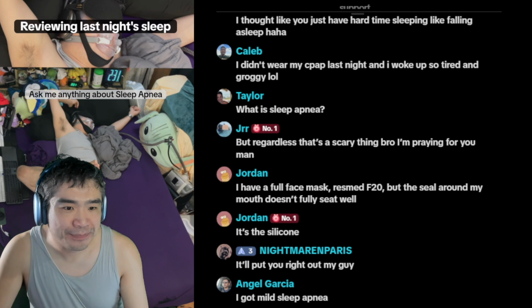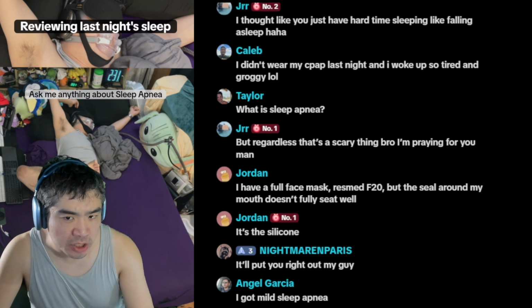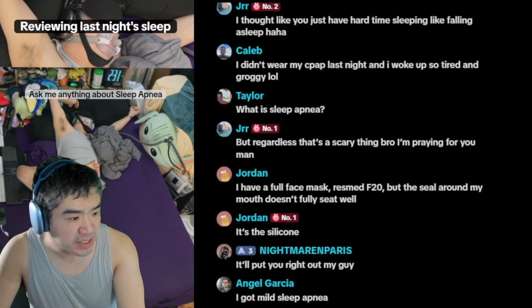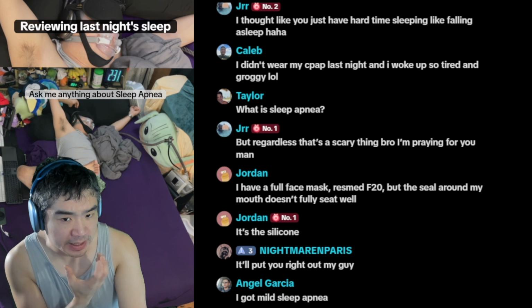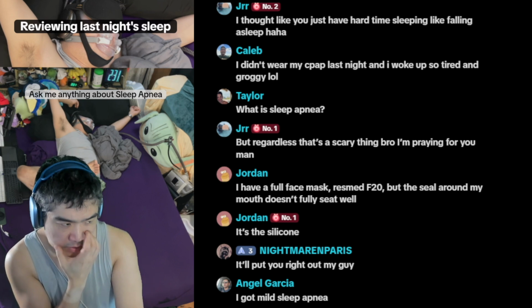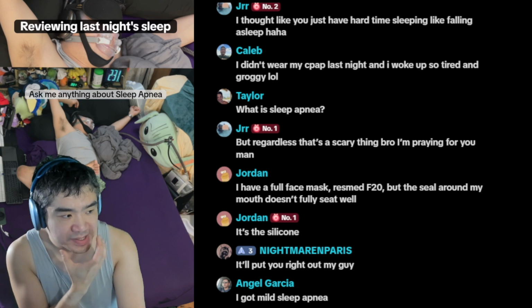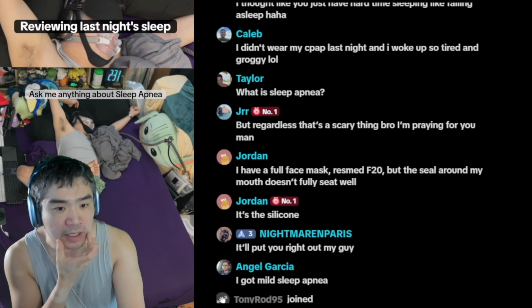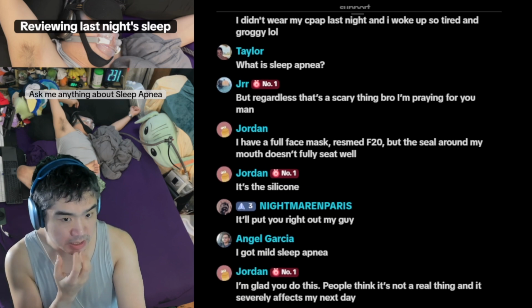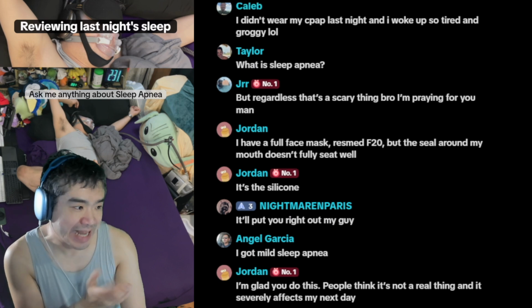All right. So Jordan, Stephen asked him about what's called the AirTouch F20. So it's the same as the F20, but it's a different style, in that it's memory foam instead of silicone. So I can imagine your beard might not make a good seal with silicone around the fine outlines of your beard, and the AirTouch F20 might. Now there are some downsides.